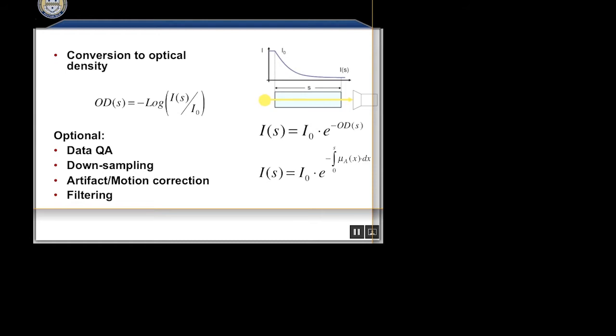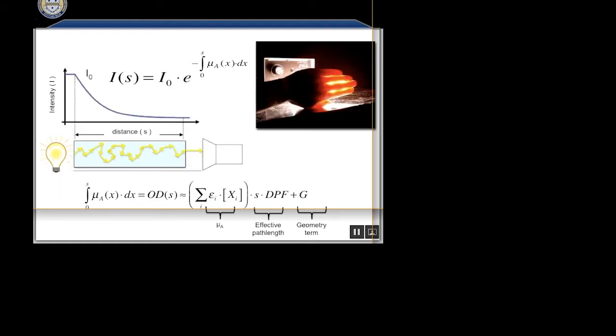In a chemistry class this is really simple because you can take a ruler and measure that distance. It's 1 centimeter across the cuvette or something. But it becomes a lot harder with tissue, where the light doesn't go straight. It doesn't go ballistically through, it scatters. We know all about this here. The light going through the tissue doesn't take a straight path. It wanders around, it diffuses.